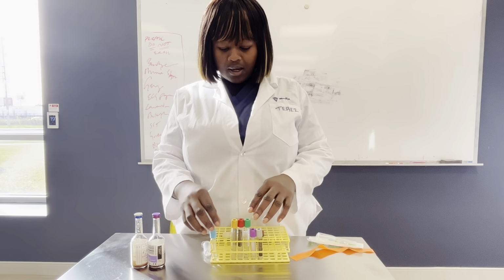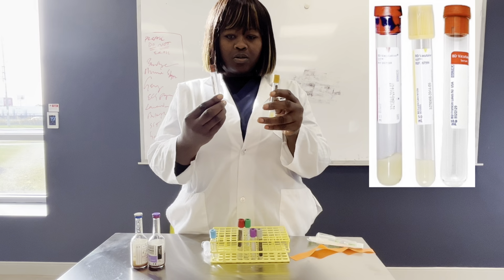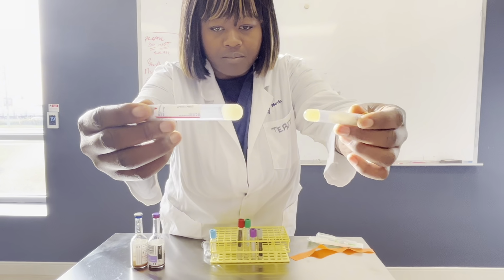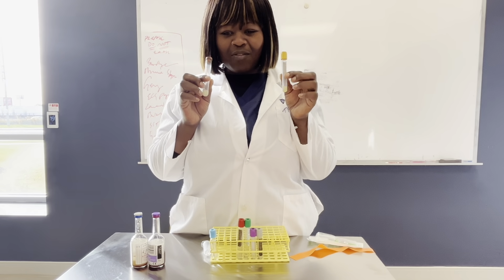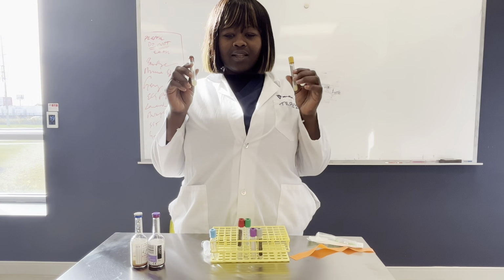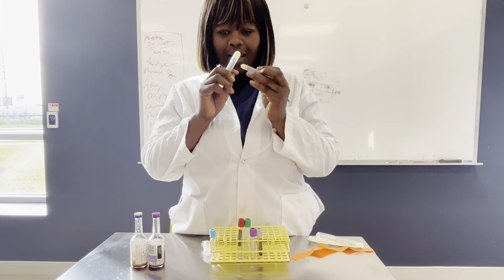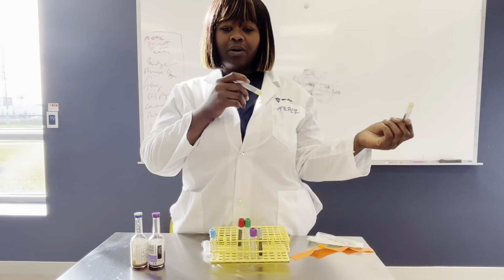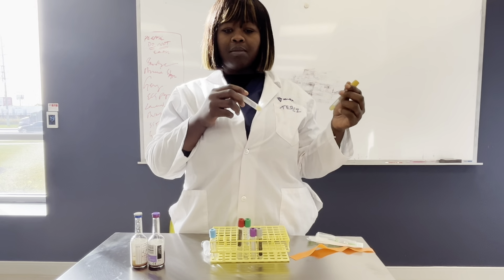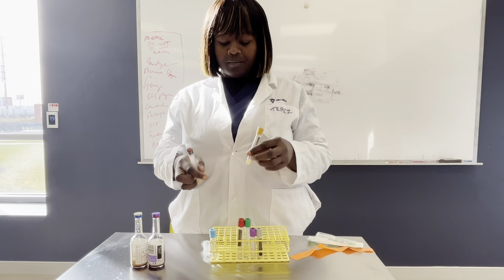So the next tube that we have are SST. It's either the gold top tube or the tiger top tube. These tubes include thixotropic gel. You can see? The gel, often found in these tubes, like I said, with the gold top or the tiger top, acts like little separators in the lab. Once the blood spins in the centrifuge, this gel clearly divides the liquid part, which we call serum, from the cells. It's a cleanup crew, making sure earlier tube stuff doesn't get mixed up in serum tests. This neat trick speeds up lab work and keeps those serum tests accurate.